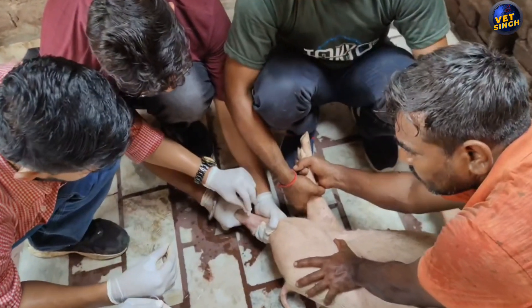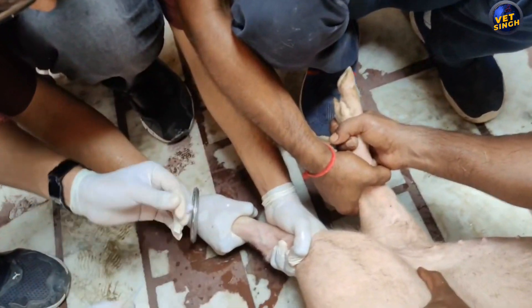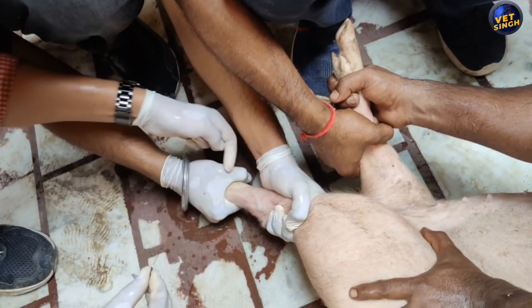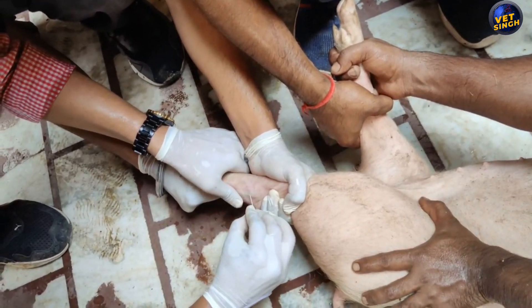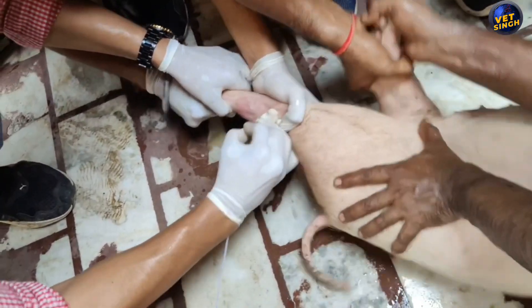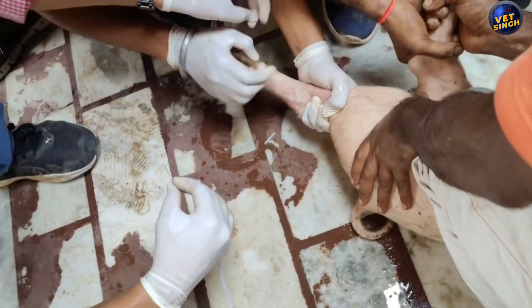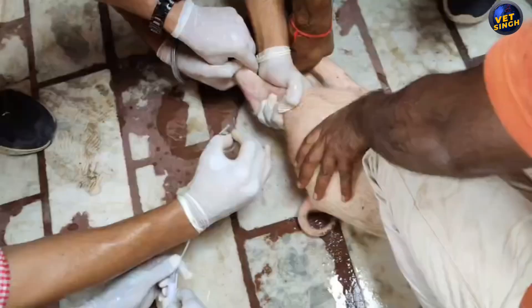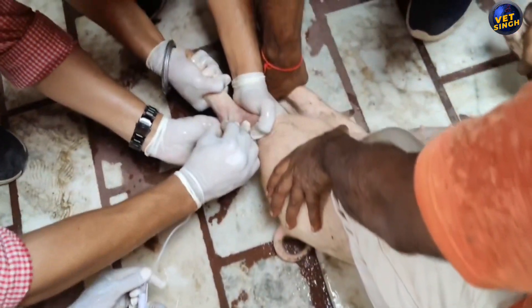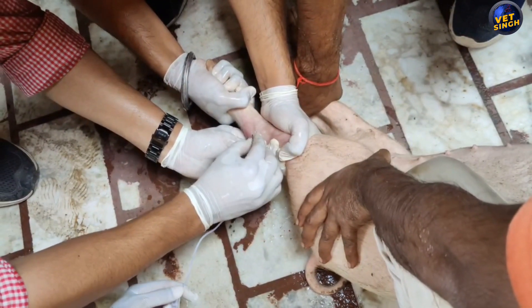In the second case, this piglet is a bit furious, so we have to take additional precautions while collecting the blood. We have to restrain the piglet with additional care. I am again applying a spirit gauze, then poking the vein with the SV set.